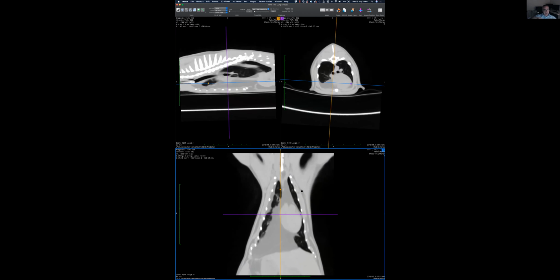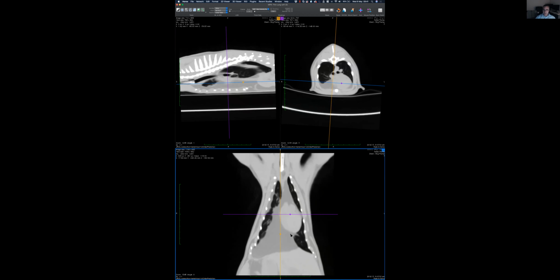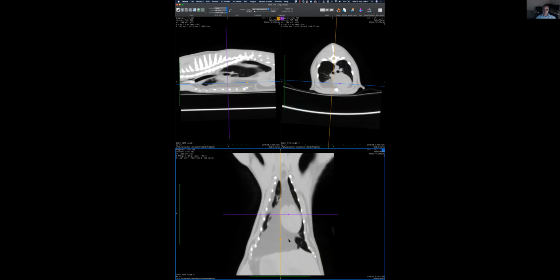They really behave more like a mass. So I would not expect, like in this case, see, this is kind of going and extending that way, and then here is not really acting like a mass. There is a shift. Somehow it's acting like a mass, but not that much. But it's a good idea. Any other idea? Maybe it's a pericardioperitoneal hernia just full of fat. Very good. So that is another option.